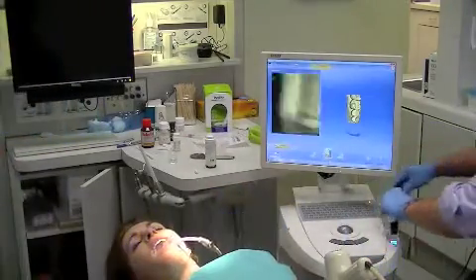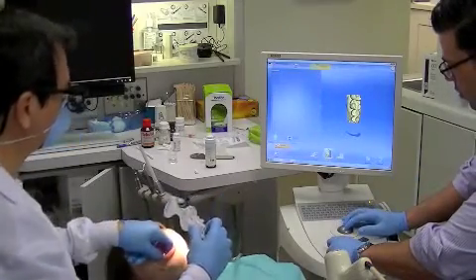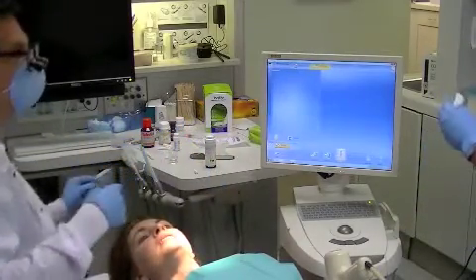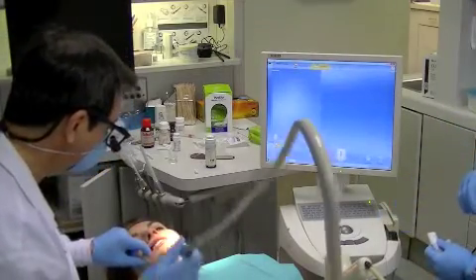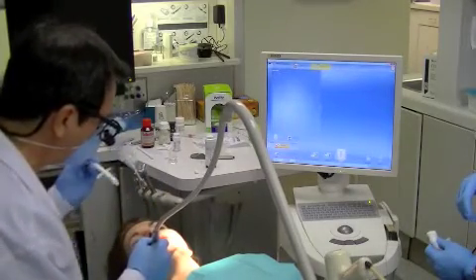Very smooth, very easy. Now we can go ahead and do a couple bites. We're going to do that without the suction in. We're going to bite together. This is to get the teeth together. That's the last picture we need.